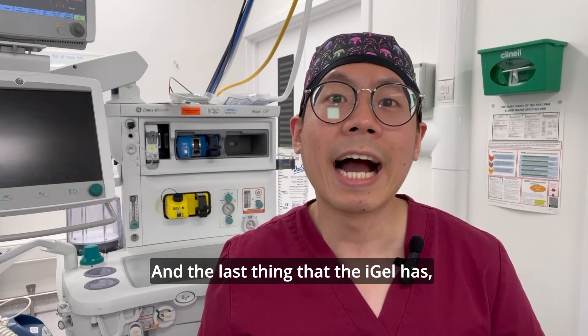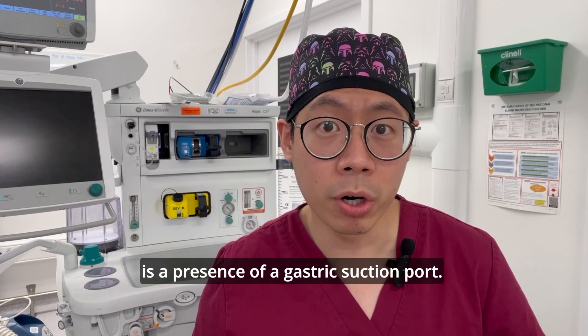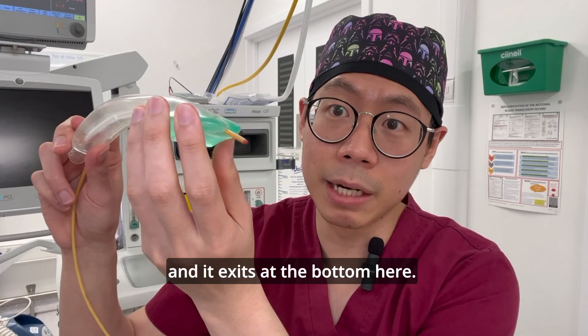The last thing that the i-gel has which the LMA doesn't is the presence of a gastric suction port. As you can see here, I've inserted a tube into the gastric suction port and it exits at the bottom.